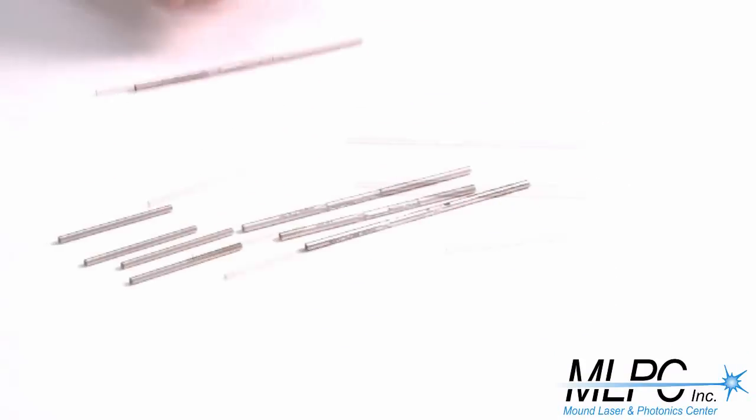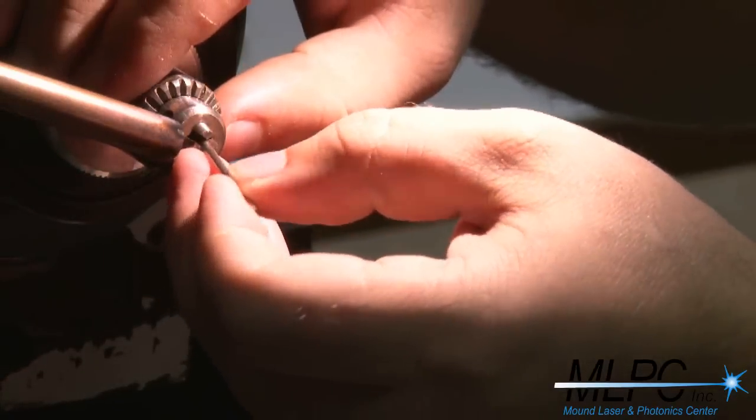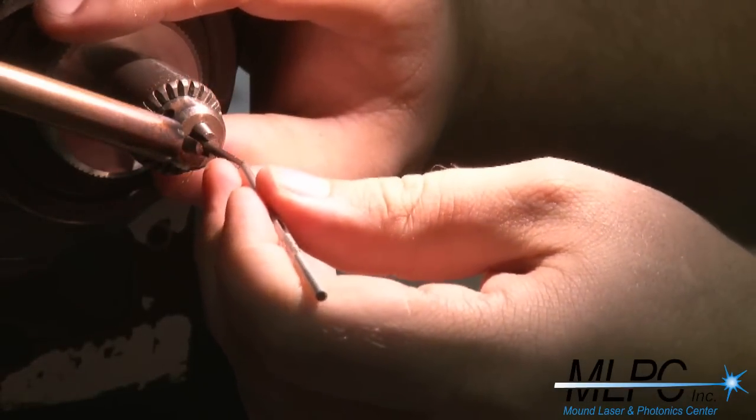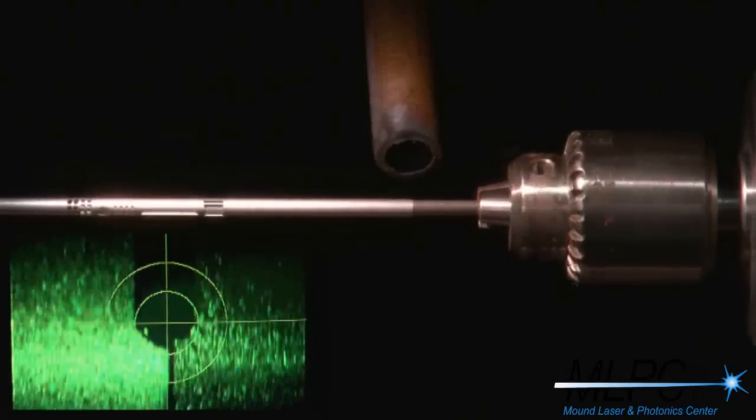After both pieces have been machined, they are sent to the laser welding department. The smaller diameter tube and the larger diameter tube are first tacked together. Then we use a rotary to process it.